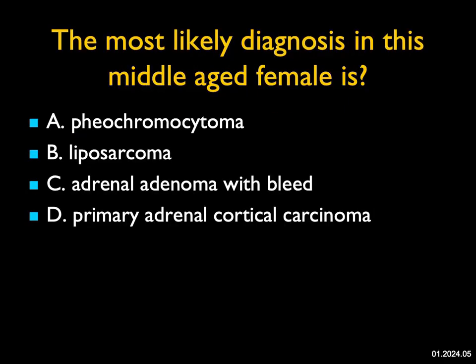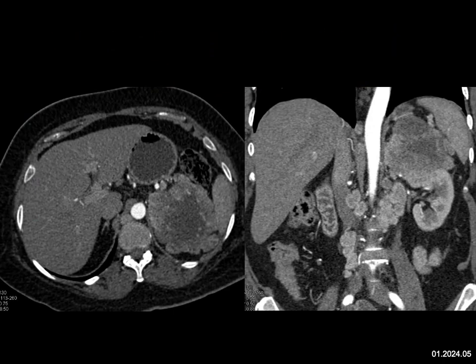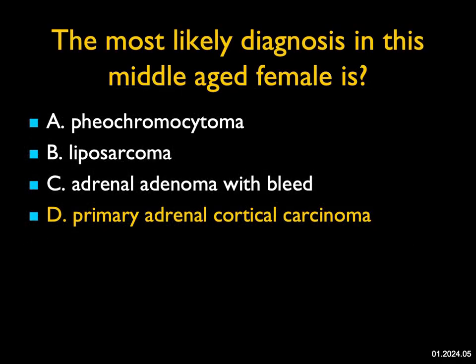The most likely diagnosis in a middle-aged female is? There's a big mass in the left adrenal gland — it's solid and necrotic, borders are not well defined, and it's pushing down and possibly invading the upper pole of the left kidney. There are no liver lesions, but there are small peripancreatic nodes. Pheochromocytomas are typically vascular and can be cystic, but this doesn't look like a typical pheo. This is not a liposarcoma and doesn't look like an adenoma with bleed. This looks like an aggressive, infiltrating tumor. The best diagnosis is primary adrenal cortical carcinoma — a very classic example.